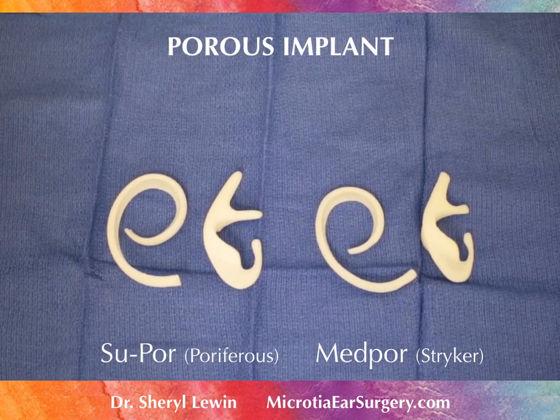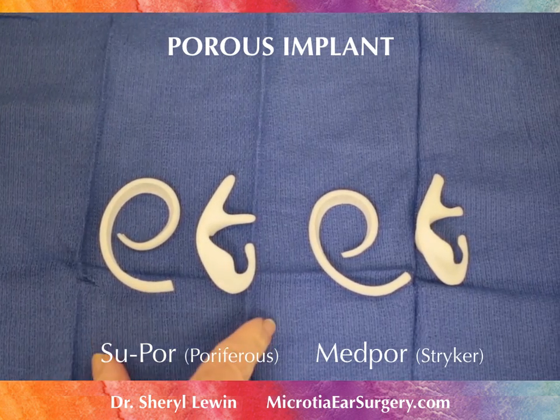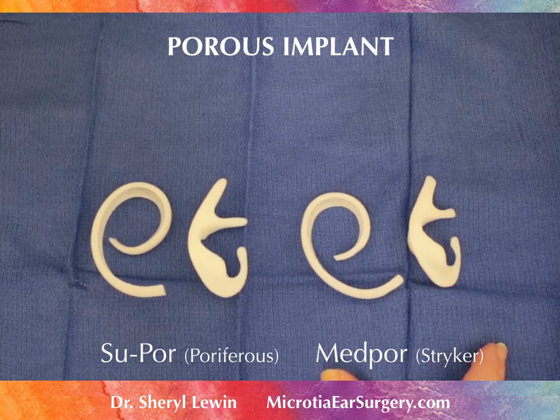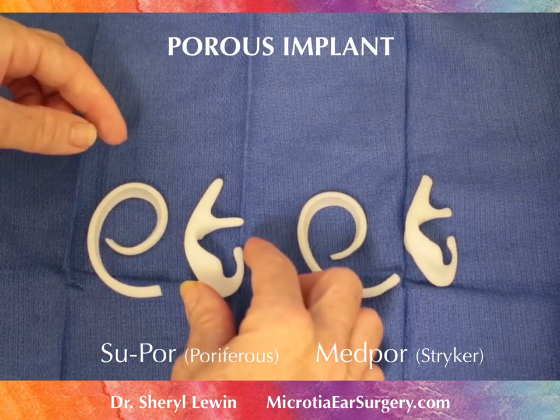There are several companies making the porous polyethylene implant. This is the SUPOR implant — the rim and the base — and this is the MEDPOR implant with the same components. You can see they look very, very similar.